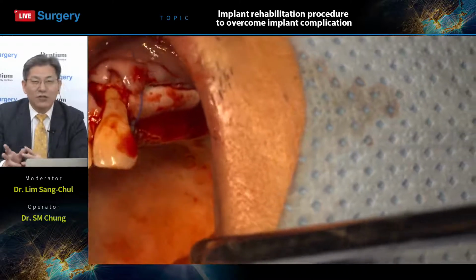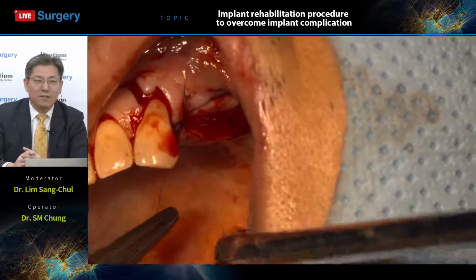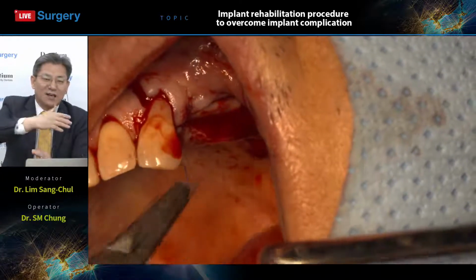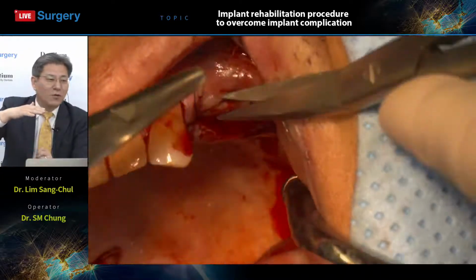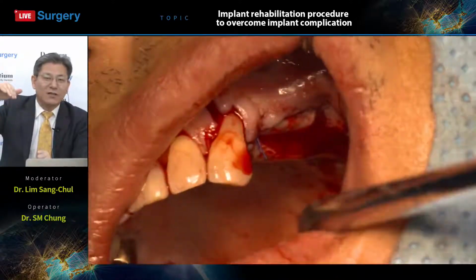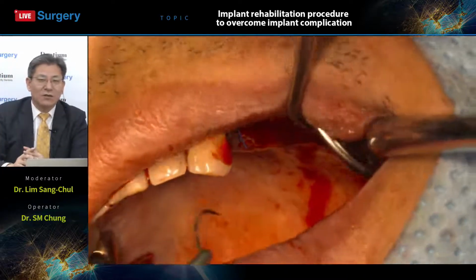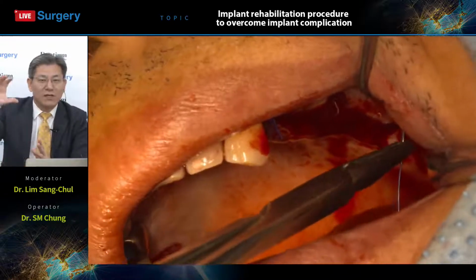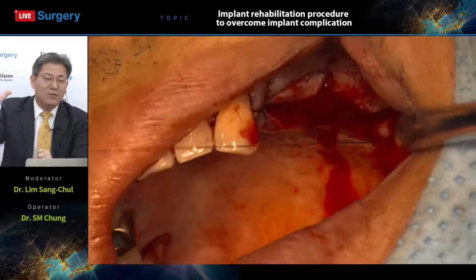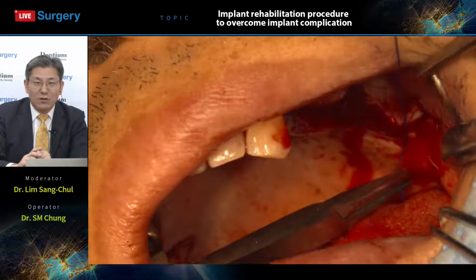So another unique character of this Bright bone level implant fixture compared to Astra: let's see, Astra starts with the lower level of insertion torque and then going deeper and deeper. Top portion, taper portion gave us a higher insertion torque, so it is a very important part, upper 1/3, right? Taper portion is important to get the higher initial insertion torque, right?